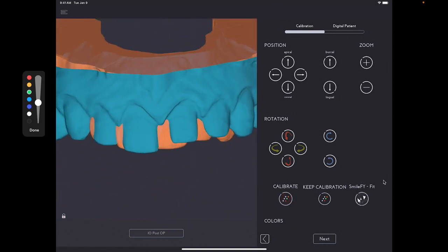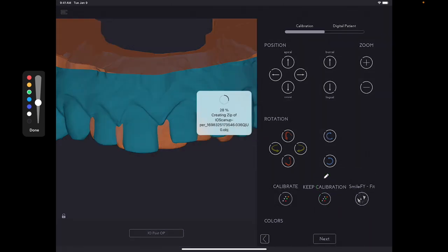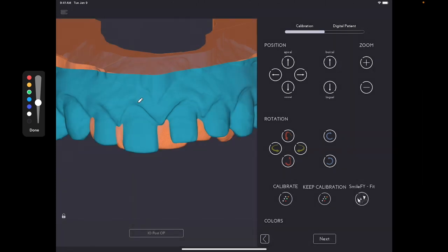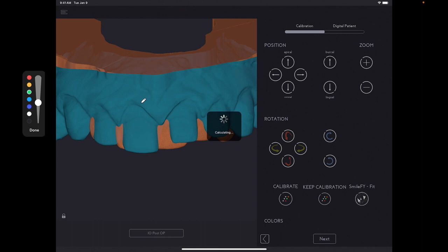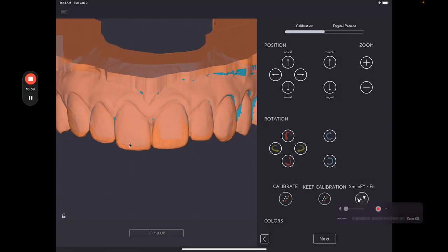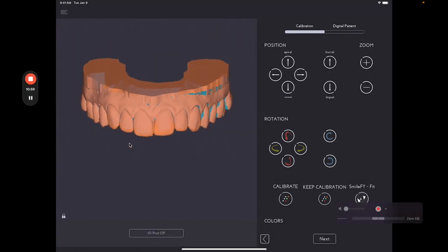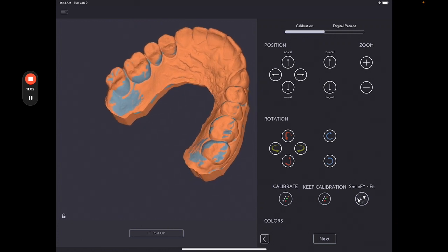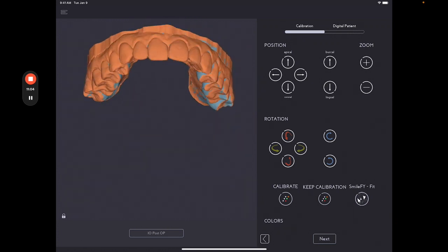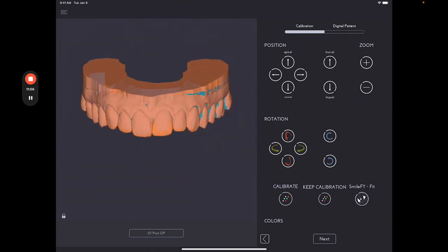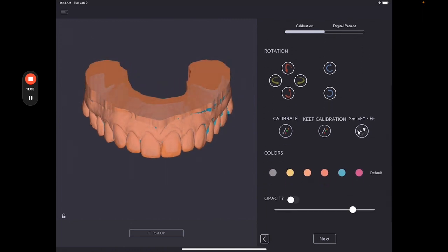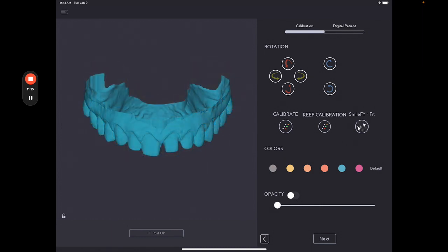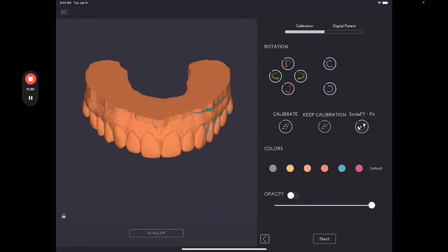Now, you can click here in calibrate. And the files will merge together. For a more precise calibration, you can click Smilefy Fit. So once you're clicking Smilefy Fit, the software basically will analyze those two files and bring them all into the right position. And now, as you can see, the files were automatically merged into one another.